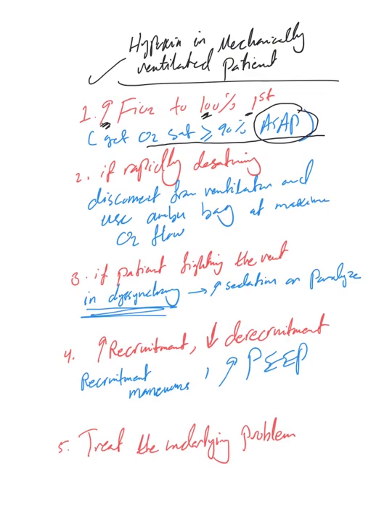Remember this, hypoxia is an emergency, which means it is a life-threatening condition that needs to be fixed as soon as possible. So the first thing I do when I get called about a patient with this, whether on the floor, intubated in ICU or not intubated, is I increase the FiO2 to 100%. This is easy on the ventilator. That's the first thing I do, because the goal now is to save the patient's life. So you need to bring the saturation above 90% as soon as possible.